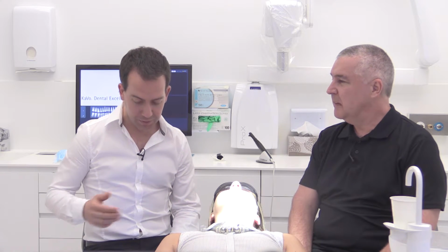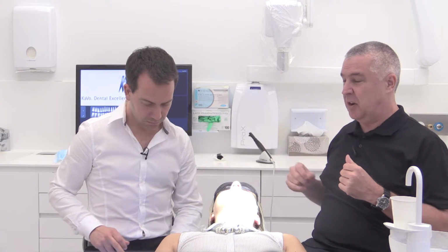I found it great. Do we need to use a barrier on the DIAGNocam? If so, does that distort the image? No, that's a really good question. So one of the things that happens when a device like this comes into Australia and goes through the process of the TGA to get approved is there's something called the essential principles. And what that means is that the manufacturer has to have worked out all the issues around infection control, reuse and sterilisation. So in the case of this device, we have essentially a large removable sheath which comes off, and that's designed to go through the steriliser. So any saliva on that is going to be removed by the cleaning process and by subsequent sterilisation. It's only an issue, as you found, when a big blob of saliva gets on the camera part itself, which just needs to be wiped off.